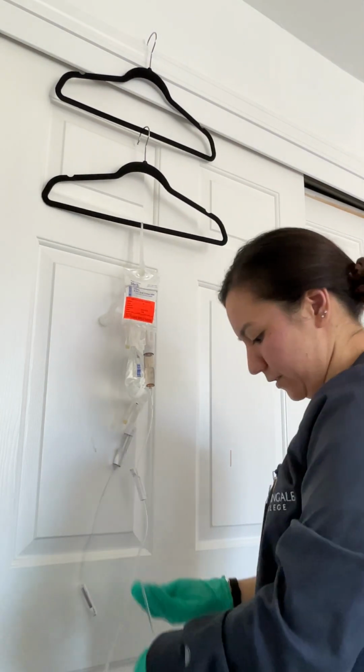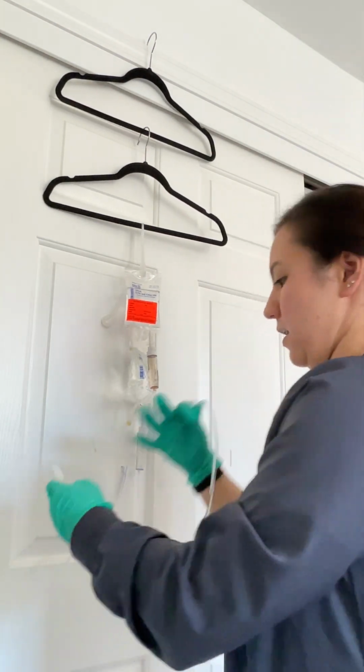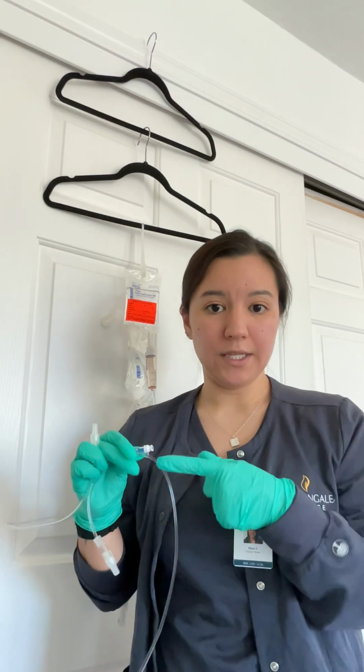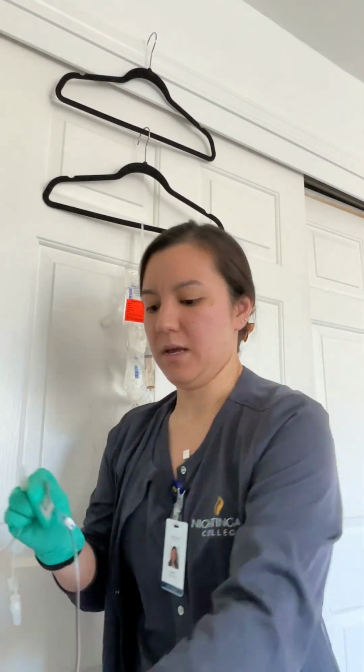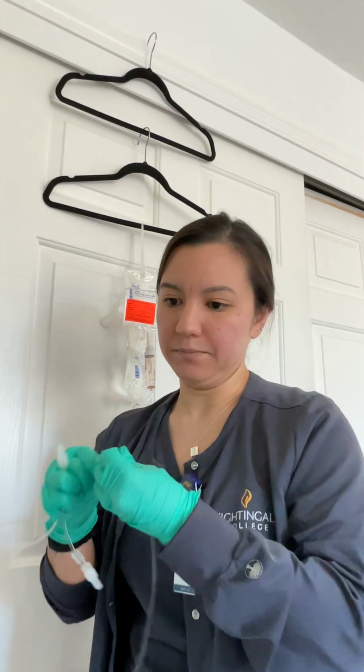All right, so now we're going to take our other IV line. We're going to take the Y port, clean it with an alcohol wipe, and let it dry completely.